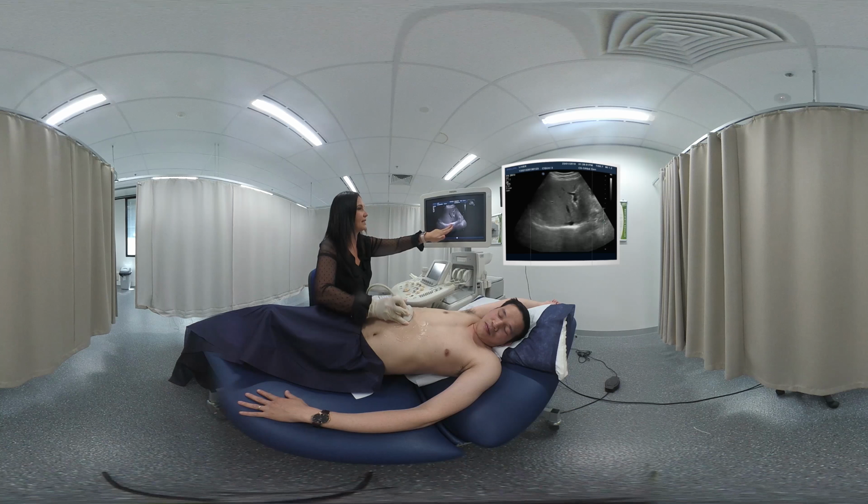Small breath in there for me. Hold your breath. Okay, so we're looking up into the diaphragm. We're right up, angling up, and then we're having a good look at all of that hepatic tissue, and we can see the diaphragm down the bottom, and we're just getting some shadowing from that gallbladder with the stones. Okay, breathe away. Okay, big breath in.